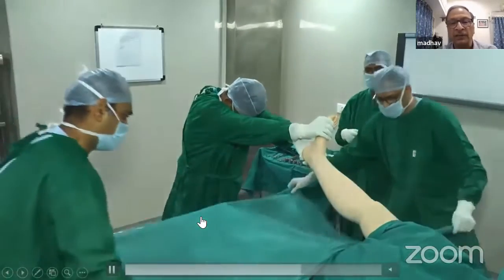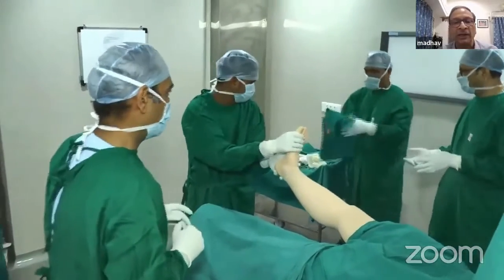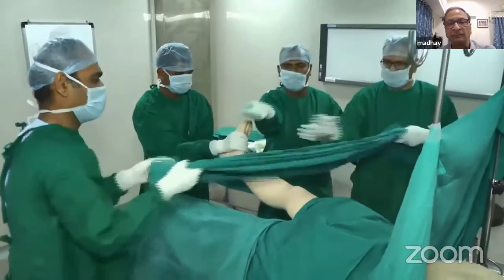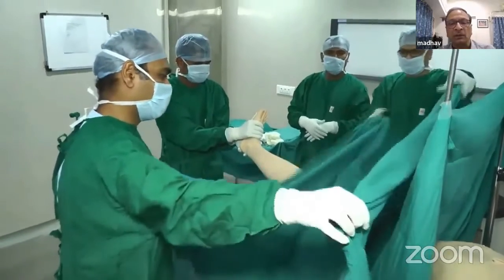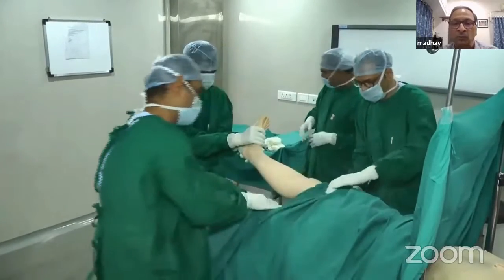Now take a big sheet, spread it, bring it up to the tourniquet, and cover the entire lower part of the table. Let the sheet go right down to the floor to cover the lower part of the table — nothing should be exposed.